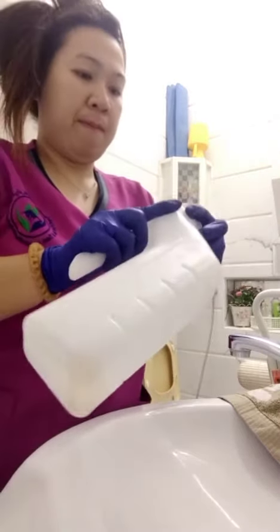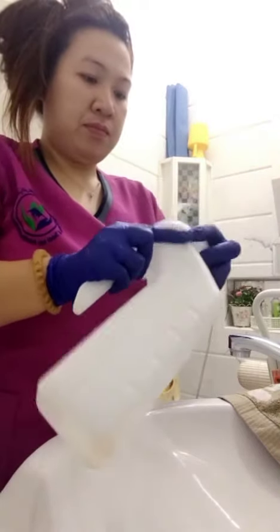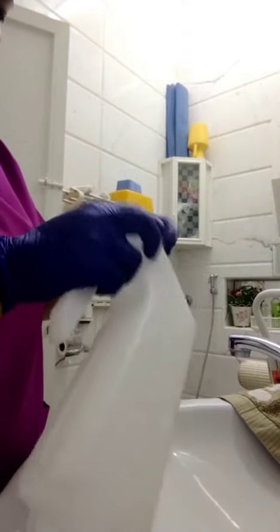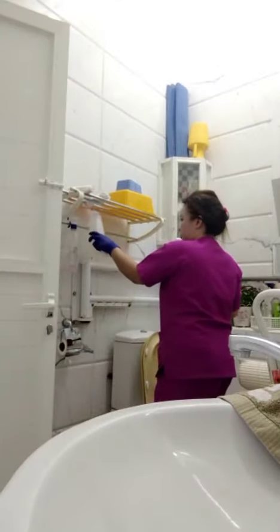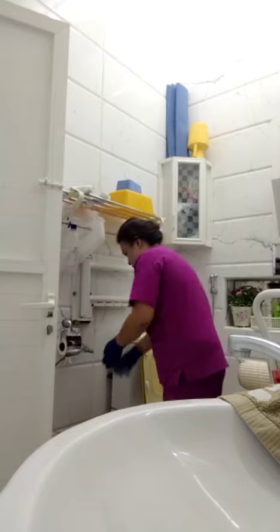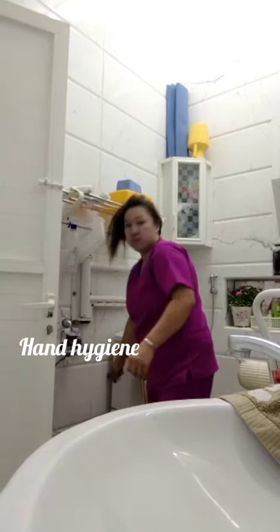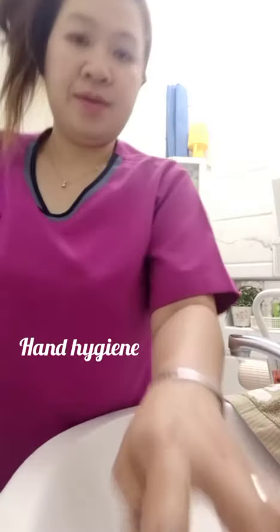Place the urinal back in the proper place. Flush the urine from the bowl. Then doff your gloves and throw them in the yellow bin.